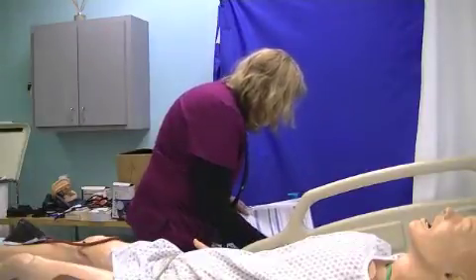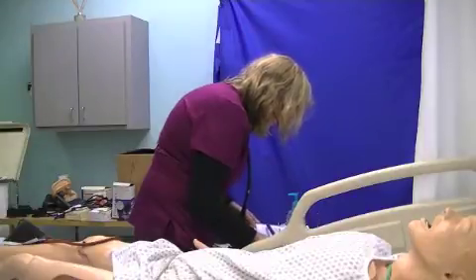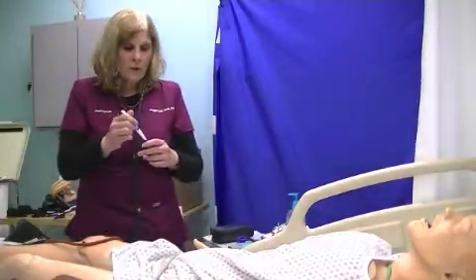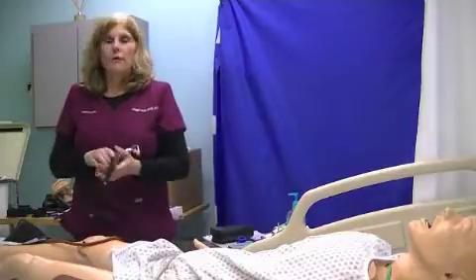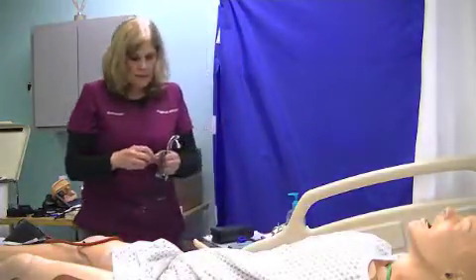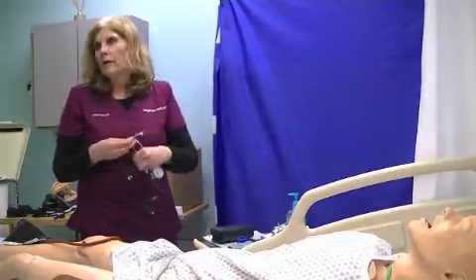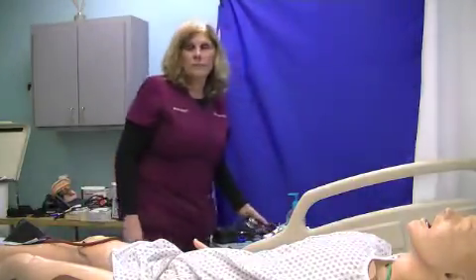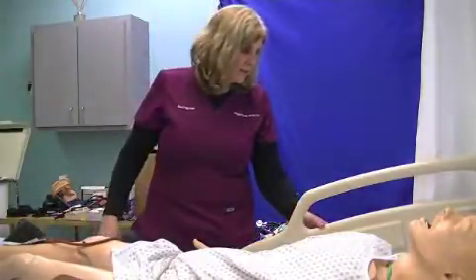Okay, and I already documented the blood pressure. If I couldn't use the arm, I'm going to write a reason why I couldn't use the arm, for example if they had a dialysis shunt. And of course, I'm going to be within 4 millimeters of mercury of the examiner. These are the tech standards that I got from the packet from the testing for the techs at the state level. So I keep up with those trends, and I add that to your competencies as well, because at the end of first semester, you're allowed to take the tech test, or what we call in California nursing assistants.